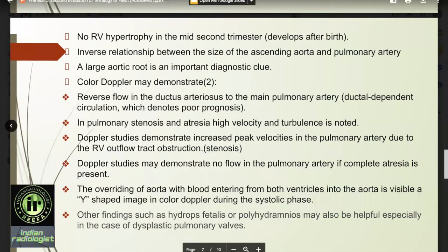Color Doppler may demonstrate reverse flow in the ductus arteriosus to the main pulmonary artery. In pulmonary stenosis and atresia, high velocity and turbulence is noted. Doppler studies demonstrate increased peak velocities in the pulmonary artery due to right ventricular outflow tract obstruction. It may also demonstrate no flow in the pulmonary artery if complete atresia is present. The overriding of the aorta with blood entering from both ventricles is visible in the form of a Y-shaped image in color Doppler during the systolic phase.